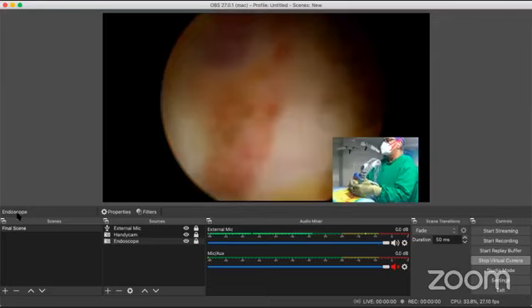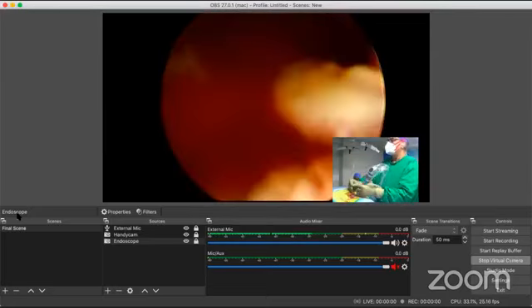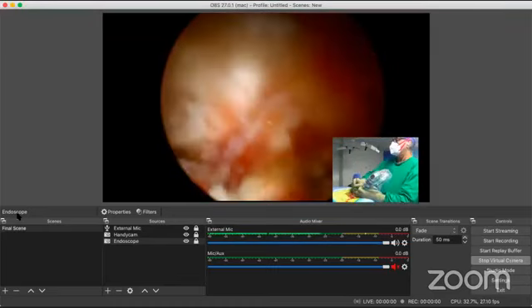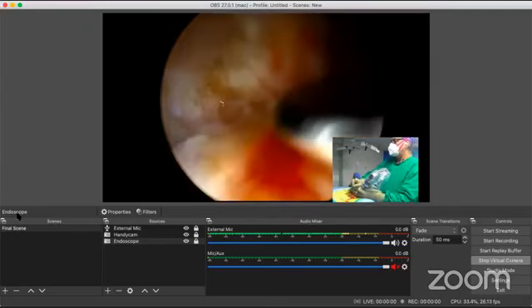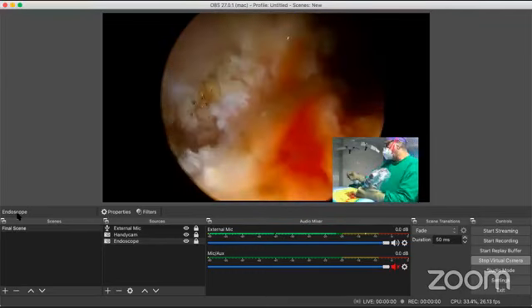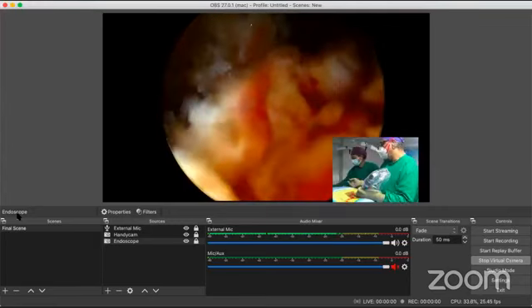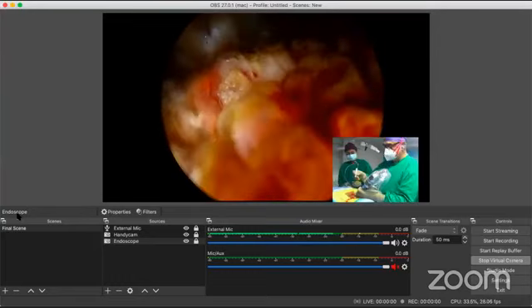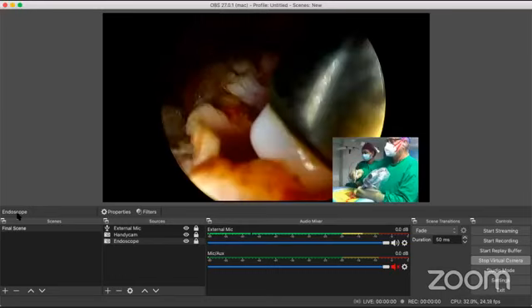Okay. One minute. There is a bleeder somewhere. We have a bleeder somewhere here. So we're going to coagulate that. Can I have a covered. I want to know where the bleeder is coming and where it is troubling me. Fire, please. Blue.